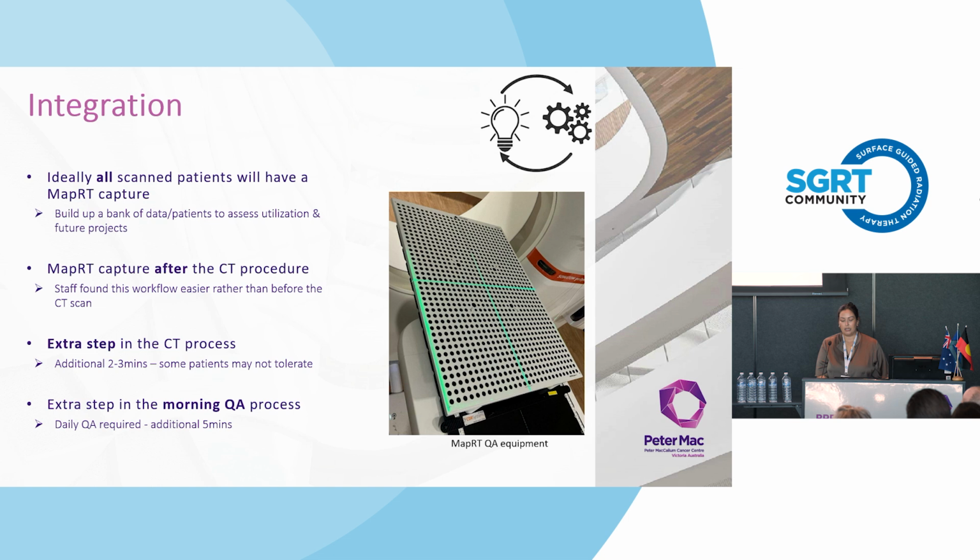In addition, MapRT also needs to be QA'd every morning prior to its use. This does add an additional 5 minutes or so to the CT's morning QA time.